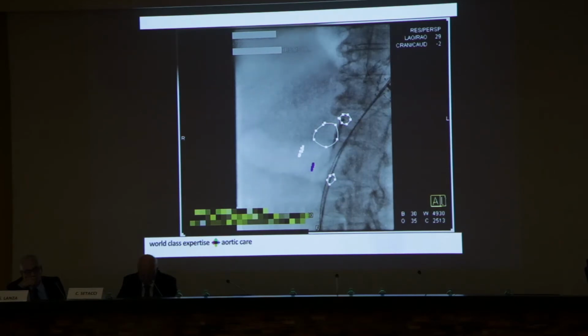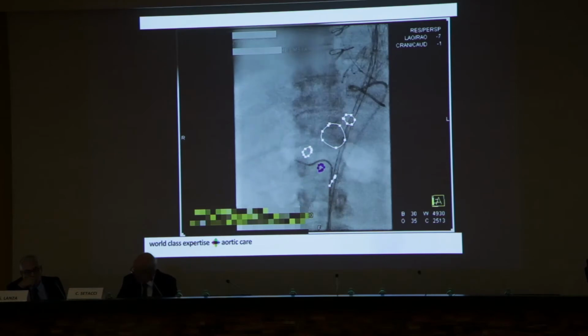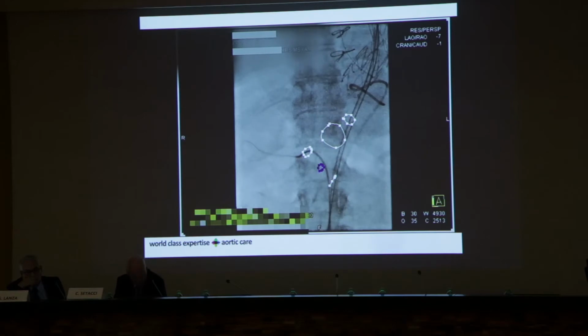We're a poor hospital, so we have only this very basic fusion, but we do use fusion imaging as much as possible. And just in case it fails, I routinely go through and mark at least 2 of the vessels with catheters so that we have a bailout if something horrible happens. God forbid, we could place a chimney or something into the renal artery and the SMA to bail ourselves out.